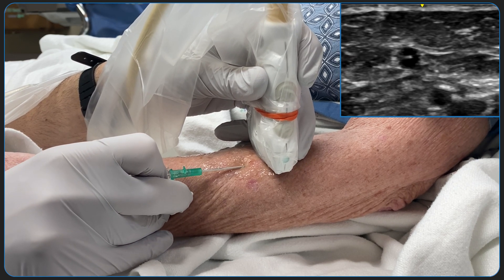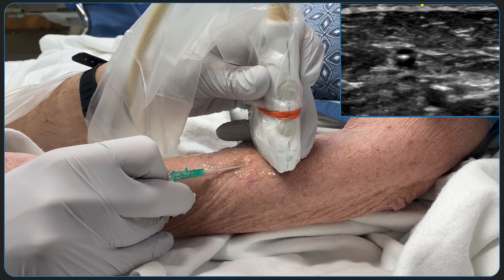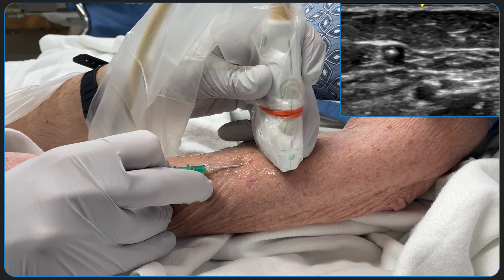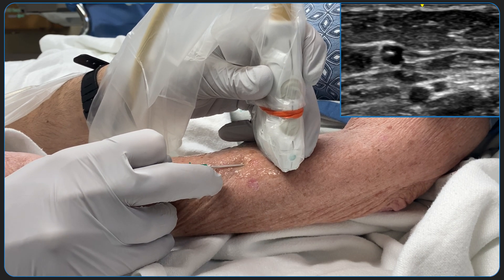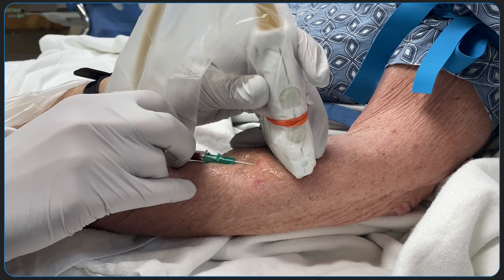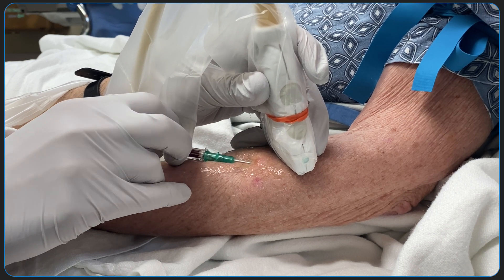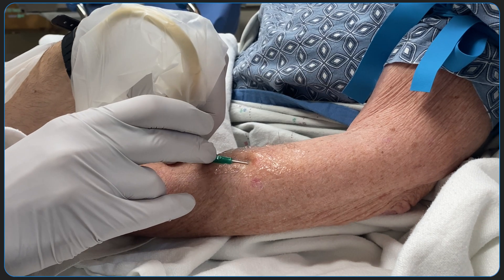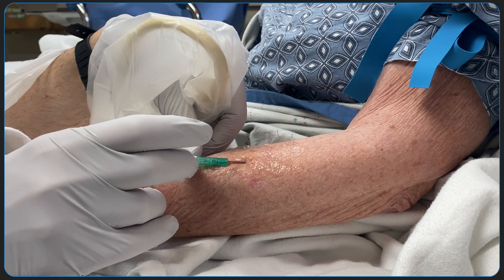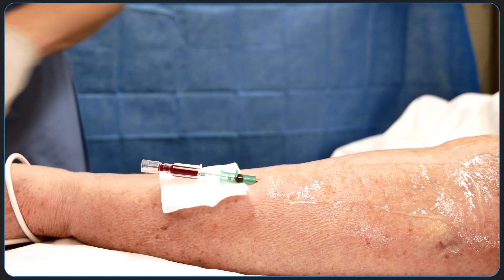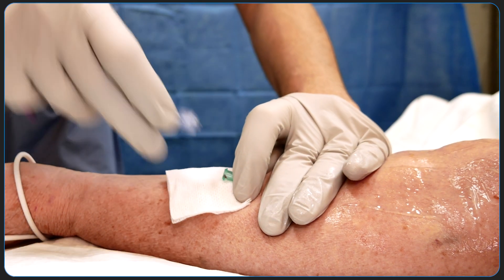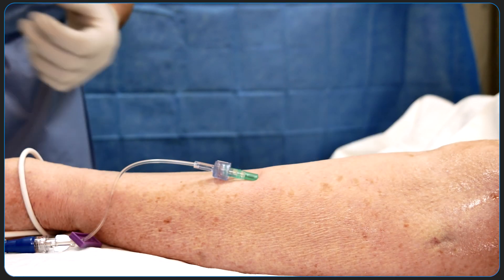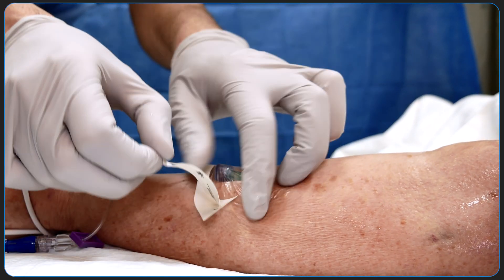The process of visualizing the body of the bevel, translating the ultrasound proximally to visualize the tip only, and then advancing the angiocath to again visualize the body is repeated to guide the angiocath into the vessel. Now the catheter itself is advanced into the vessel. Sterile tubing is connected to the indwelling catheter and then flushed. The intravenous line is then secured and dressed.